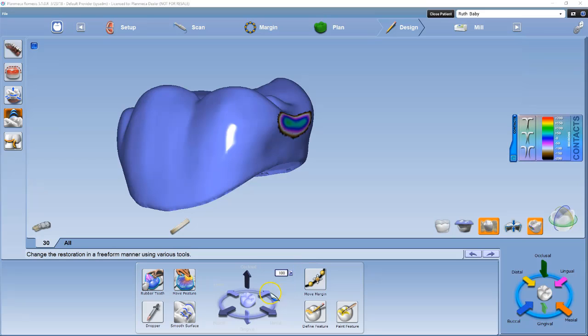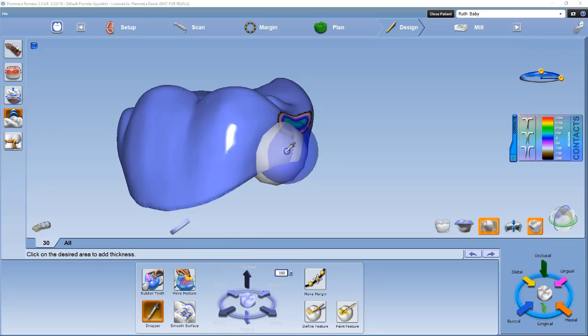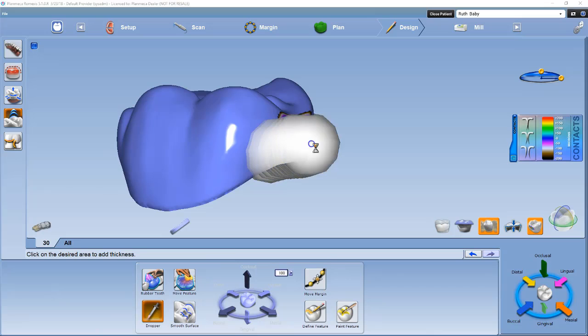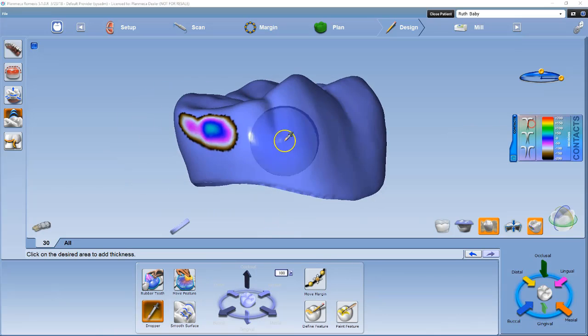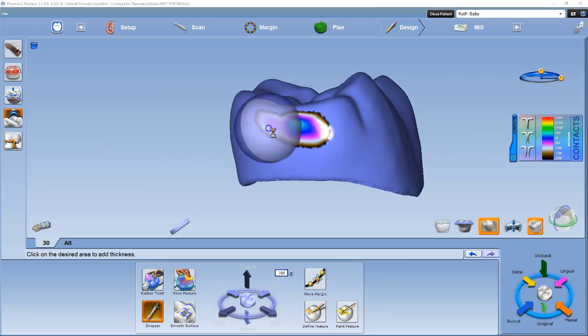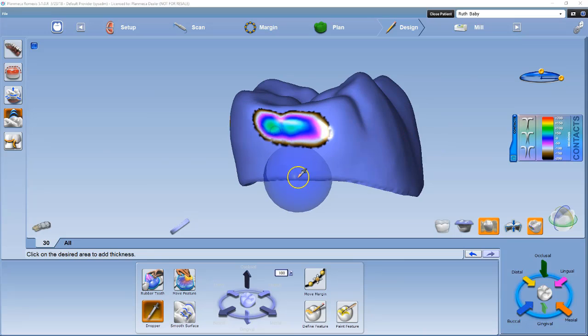The dropper tool can be used to add to deficient areas such as concavities, a light interproximal contact, allow you to broaden interproximal contact, and add material to thicken the margin for milling.